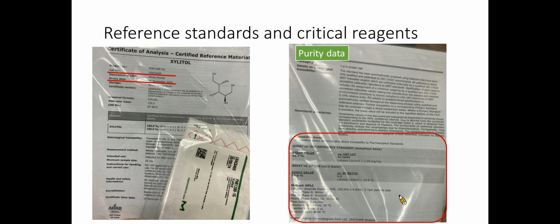The purity of reference standards used to prepare calibrators and QC samples can affect the study data. Therefore, you should use authenticated analytical reference standards with known identity and purities to prepare solutions of known concentrations. The reference standard should be identical to the analyte.